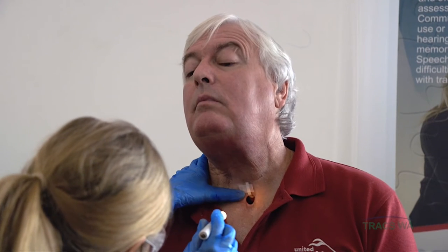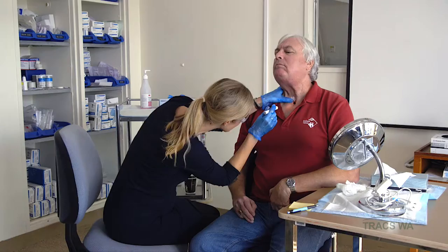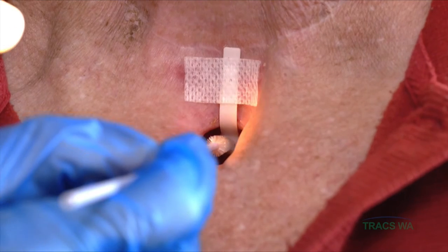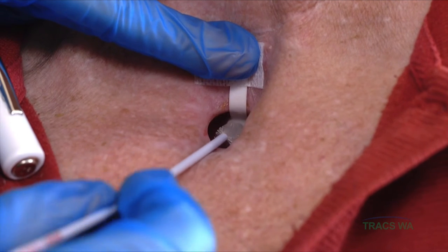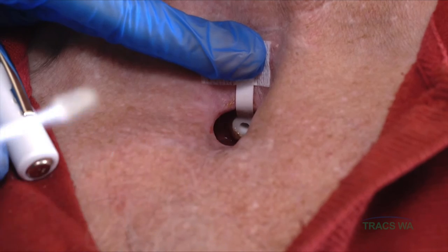Oh, it all looks really clean and clear of secretions. I can see the valve and that's all there and it all looks fine. I'm going to start by just giving it a clean. Sometimes that's all we need to do. Give that a try.